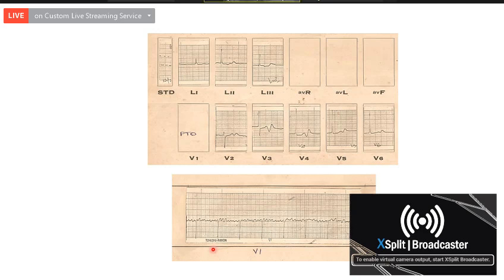So what are the things that you can deduce? This patient is having atrial fibrillation, complete heart block, then prominent U waves, coarse atrial fibrillation, and LVH. So what are the conclusions that you can draw? Restrictive cardiomyopathy.